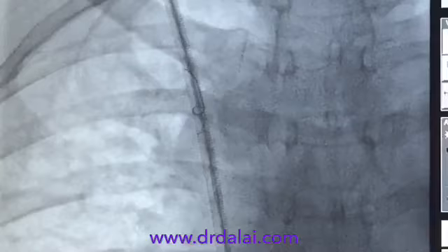And you should know where your IVC is during this procedure. Once we get inside, you can check, my Chiba is inside the sheath. Then once my Chiba is inside the sheath, put your 14 wire going all across over here. This 14 wire goes up into the sheath, and once you have achieved that, I am pushing my wire all the way up. You can see my 14 wire through the Chiba has come here, and I'm quite safe and it feels great.